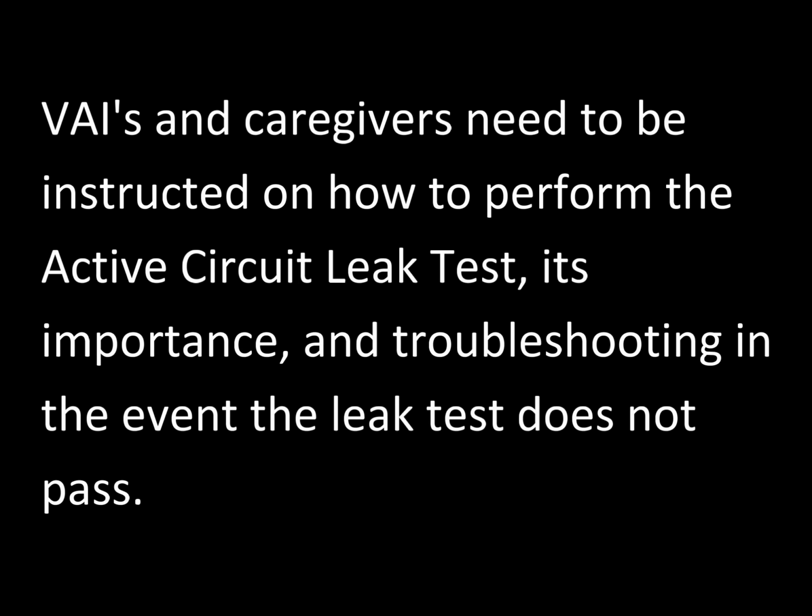Ventilator-assisted individuals and caregivers need to be instructed on how to perform the active circuit leak test, its importance, and troubleshooting in the event the leak test does not pass.